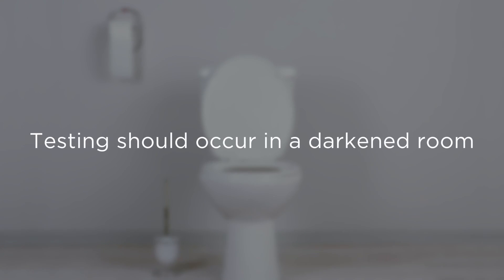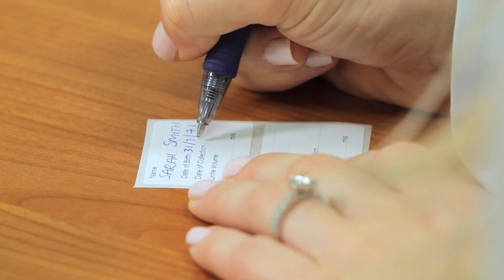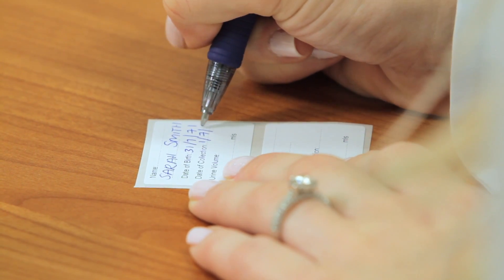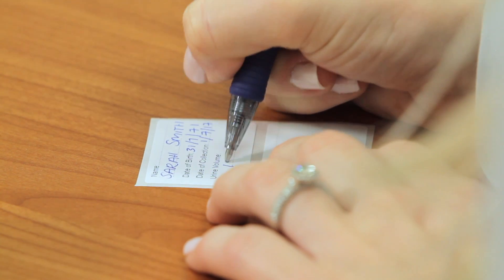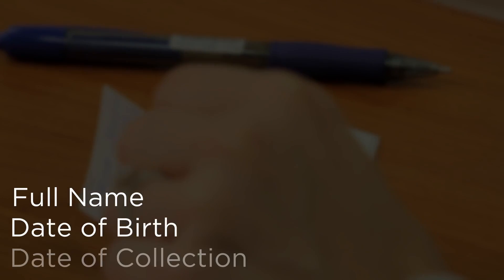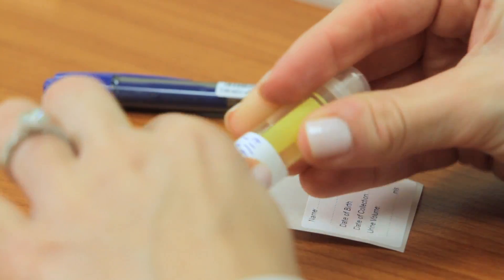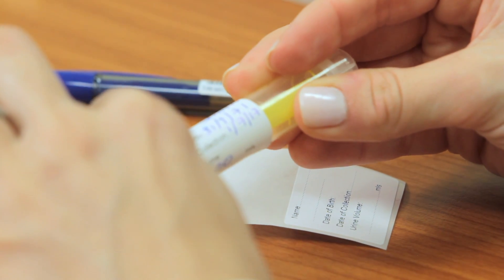In order to get the most accurate test results, a urine sample will need to be collected in a dark room with minimal to no lighting. Prior to entering a dark room, label both the yellow urine Monovet and the dark blue screw cap tube with the two adhesive labels provided in the test kit. Complete details on two adhesive stickers with the following information: full name, date of birth, and date of collection. Place a sticker on the yellow urine Monovet and dark blue screw cap tube.